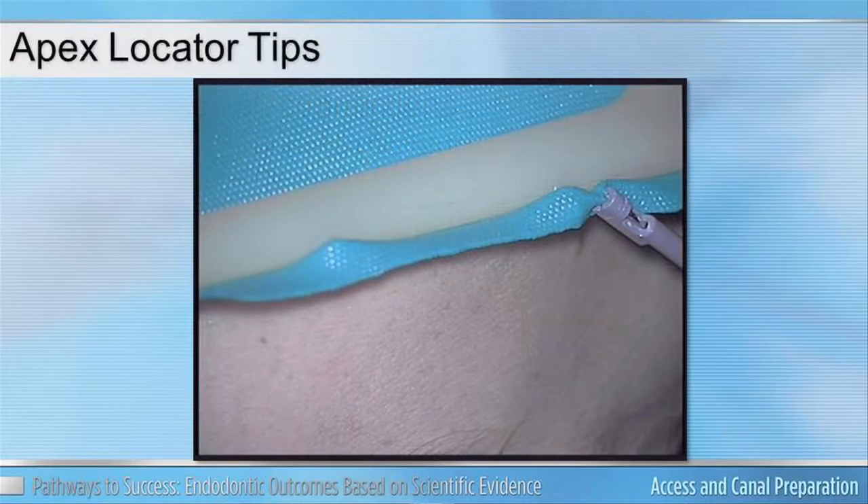Last, when you have the rubber dam on, here's a simple but useful trick: take your file clip, extend it out, and clip it onto the rubber dam itself during your treatment. That way it's easily accessible the next time you need it during the case.